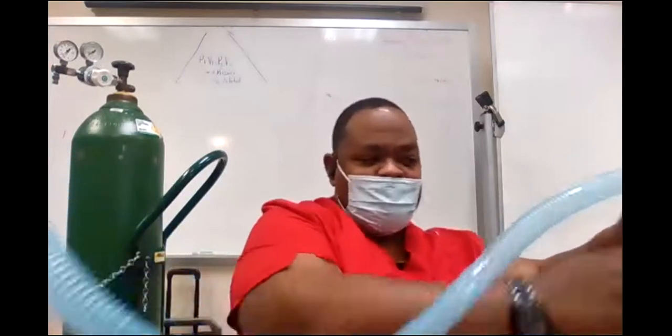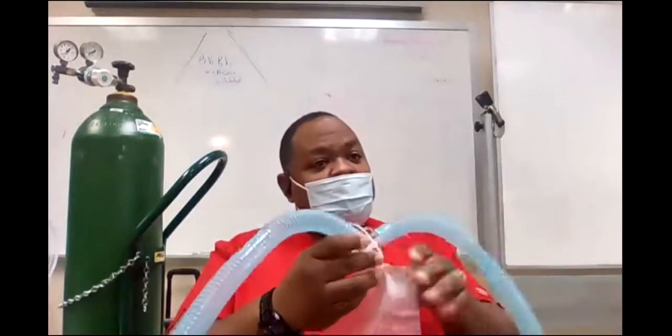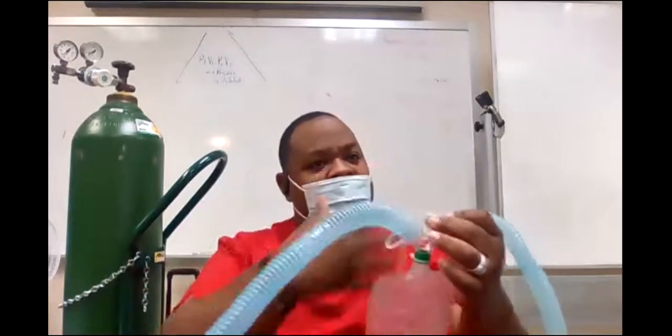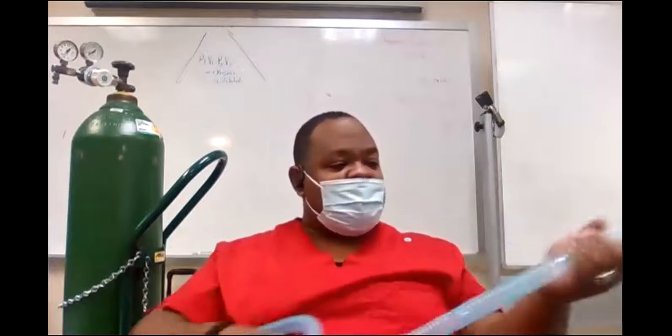So I'm going to cut right here and put the bag in between there. That way the bag is there to catch the water that collects, okay, just simply by gravity. And this will be 1 and this will be 2, and have my bag in the middle. Okay. But for our sakes, we have 2 large bore tubings that we connect them with a water bag. This water bag will catch the excess water as it rains out. Okay. And then you have this end, which goes to the patient.